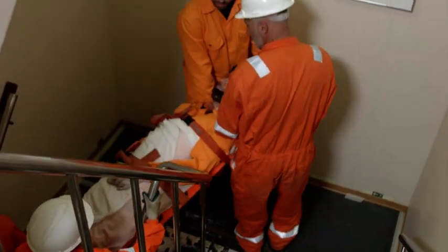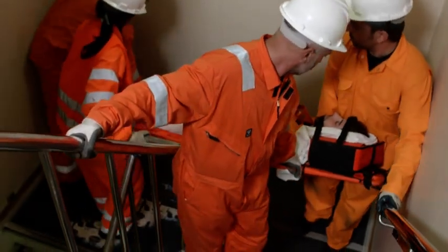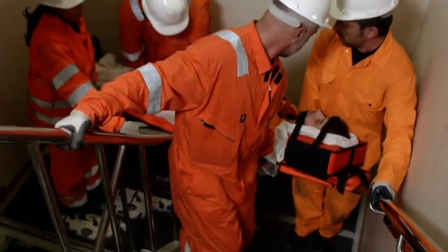When dealing with a spinal injury, a spinal board would be more appropriate, as it is made of rigid plastic with a series of straps and head blocks to secure the casualty and maintain the alignment of the head, neck and back.